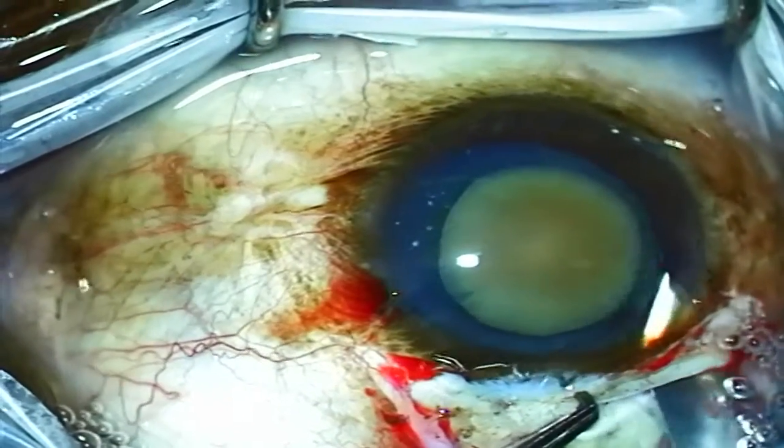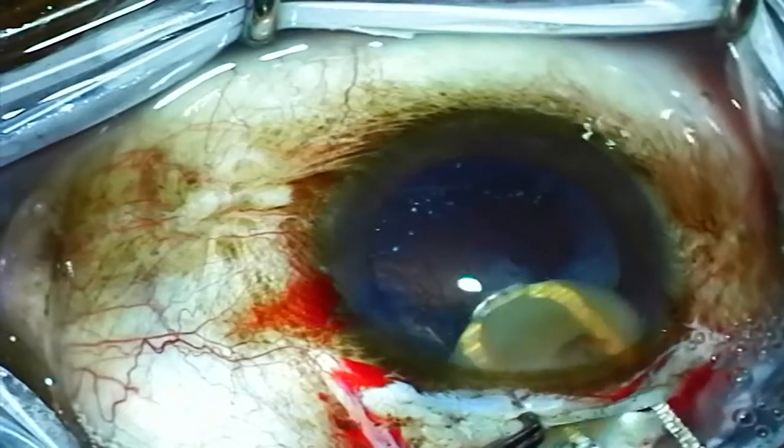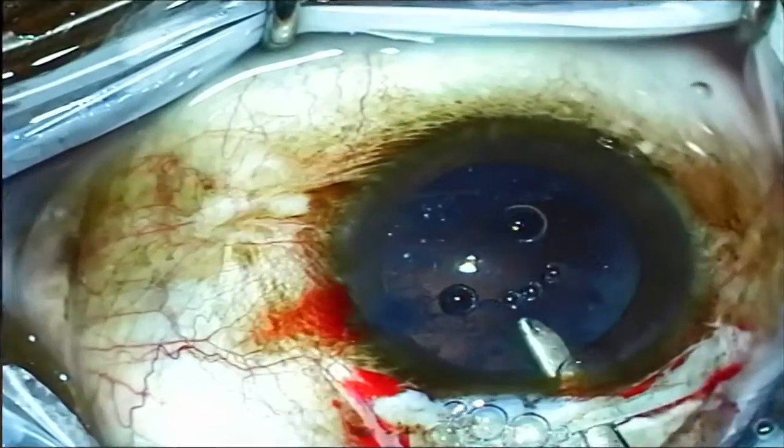The incision is then enlarged with the keratome blade, just big enough to remove the lens nucleus. Then a lens loop is used to express that lens nucleus from the eye.